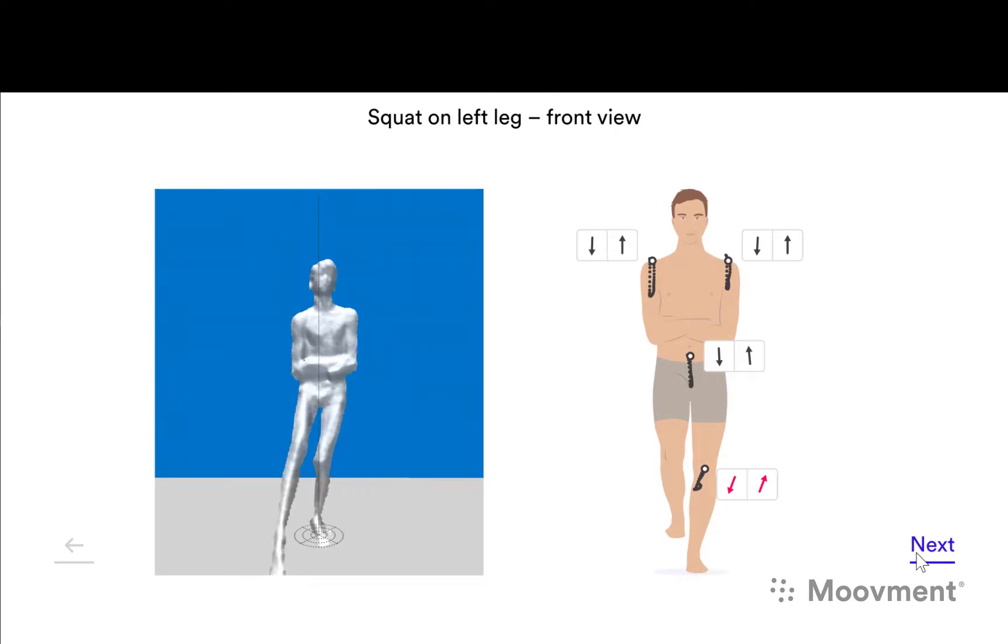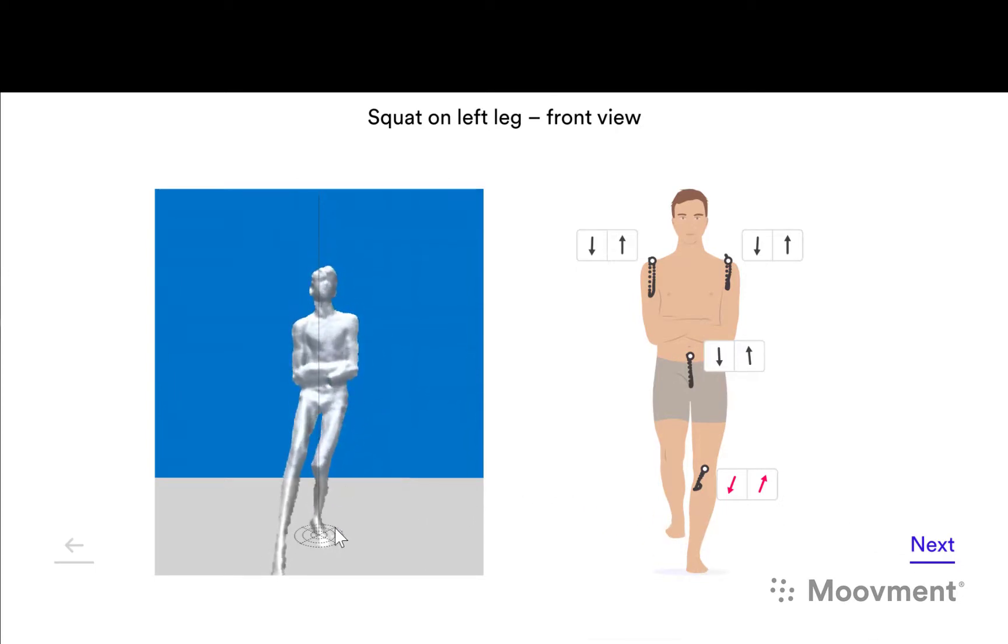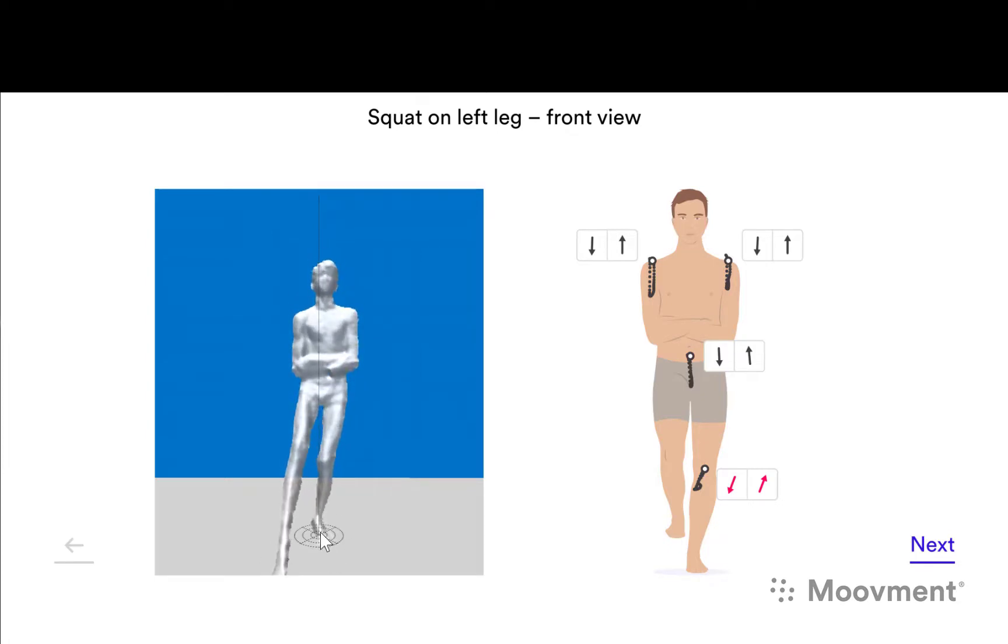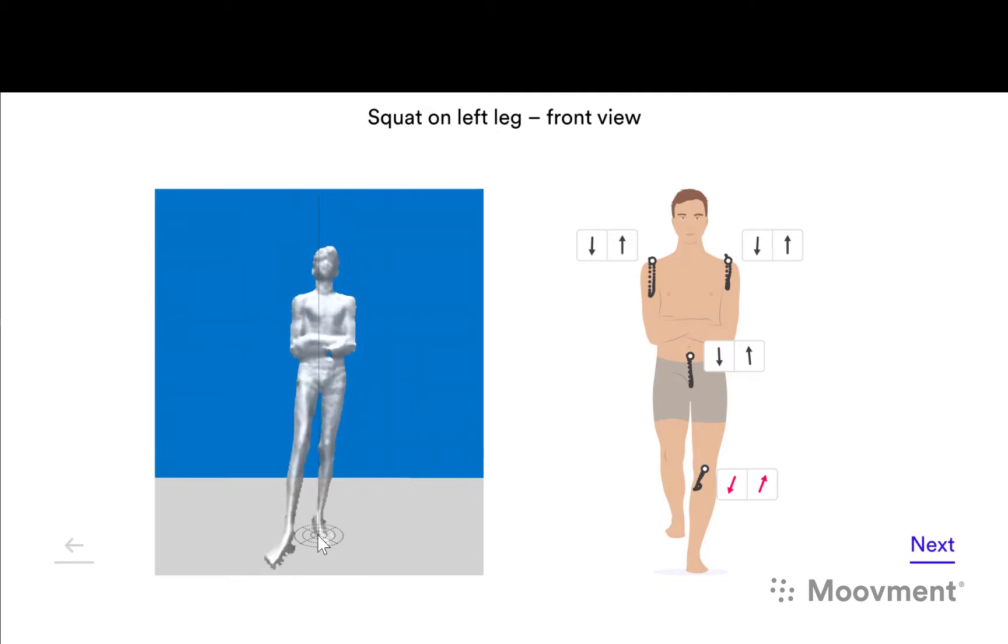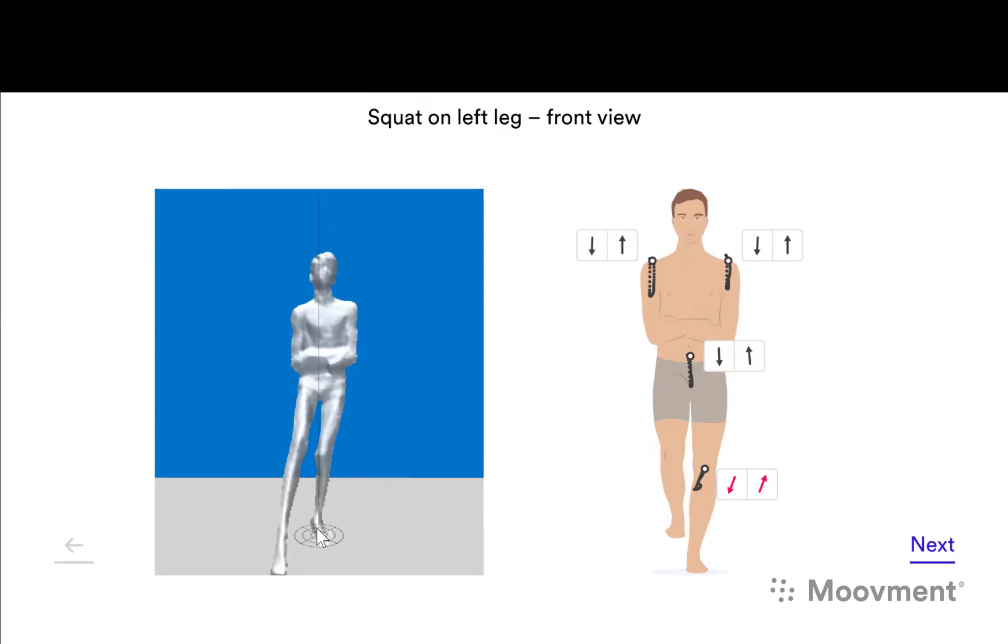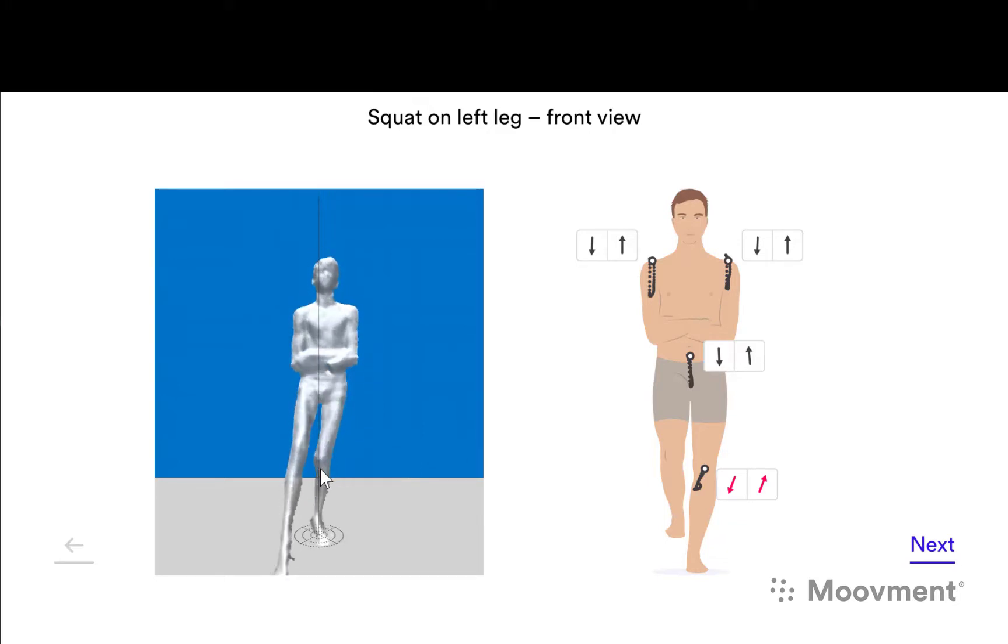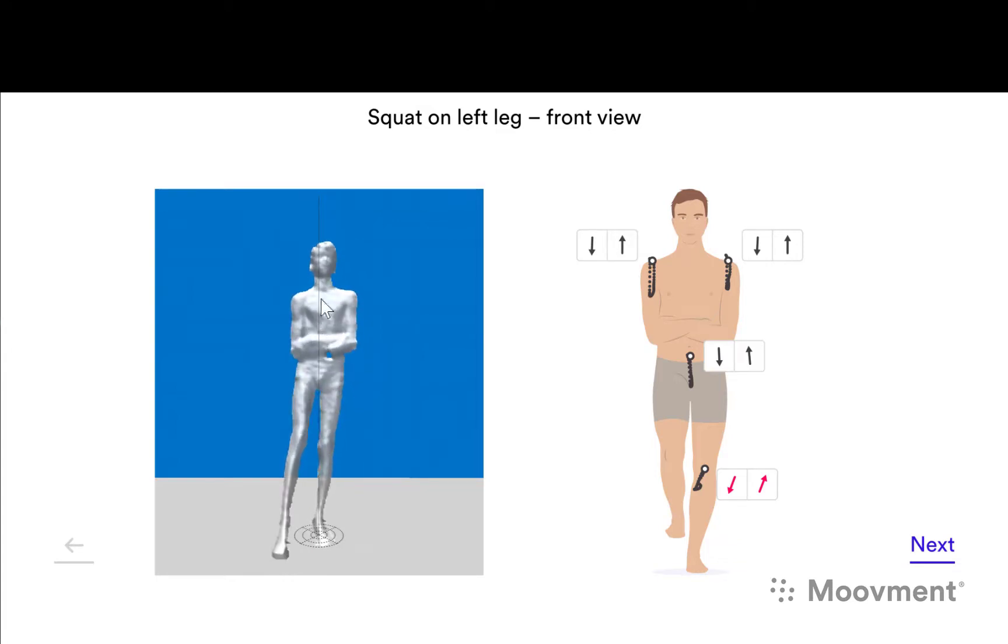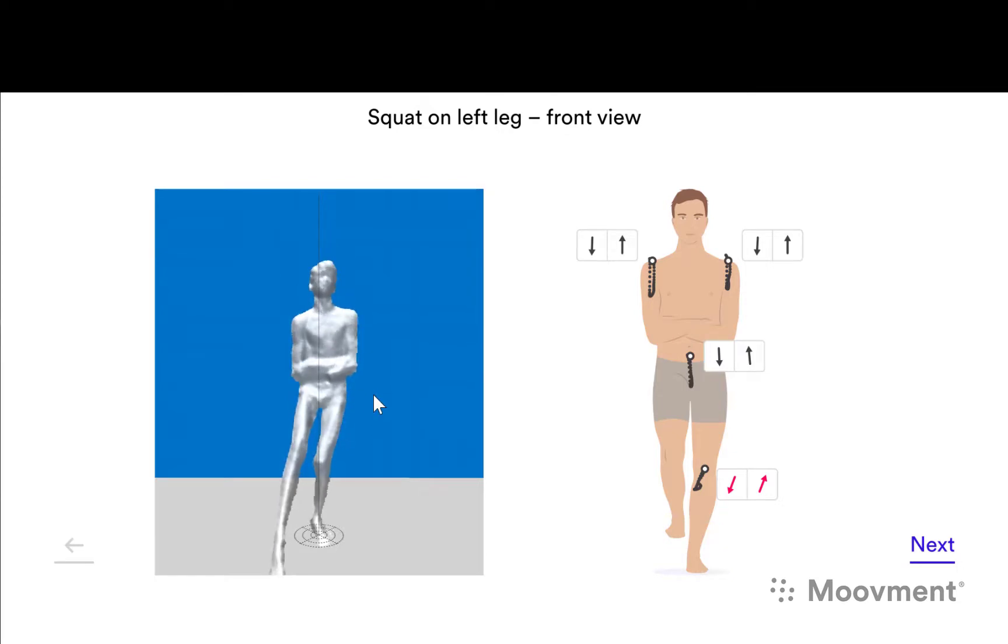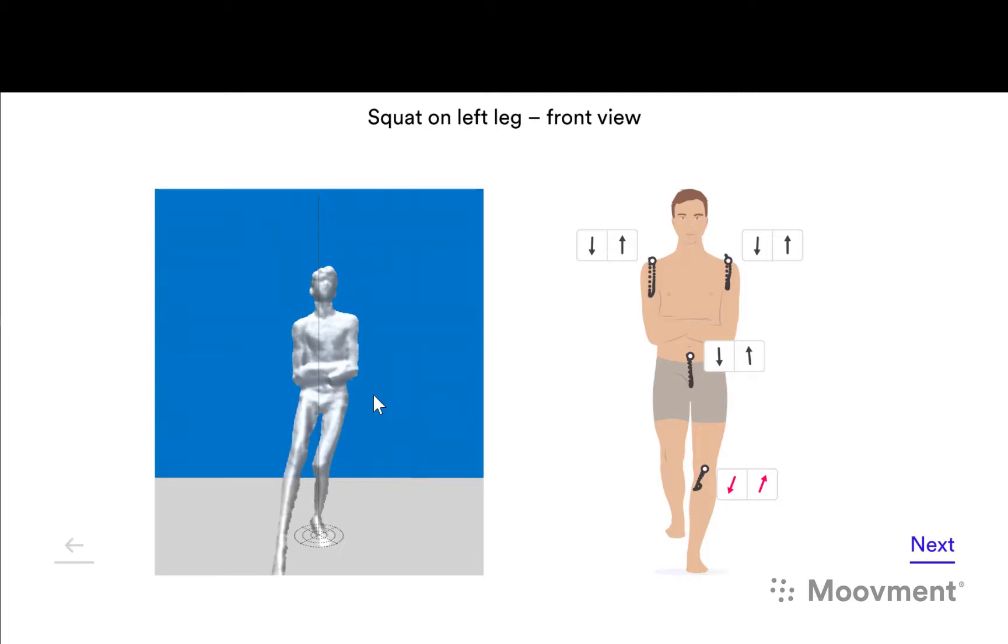Single leg squat can be observed in a similar fashion from top of squat to bottom of squat. In this case, when at the top of squat, the foot tends to be in a little bit of pronation but it's a more neutral position. It really is towards the end of the squat the foot falls into a pronated position and the knee falls in towards the line of gravity. His trunk is fairly upright but he's trying to compensate with his shoulders, and the hips are sticking out to the side, and this would be what you might call a postural orientation error from the literature.